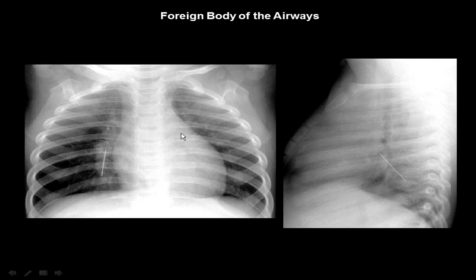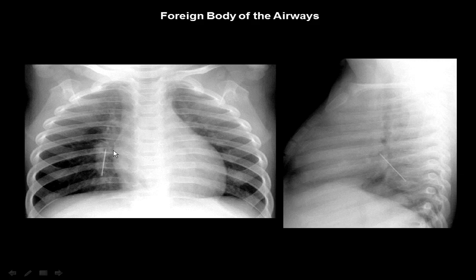This is a plain X-ray film, posterior-anterior and lateral view, showing a metallic shadow in the right lung hilum. In this case, the patient swallowed a needle. This needle can take two pathways — either go to the airway or to the GIT. Here it went to the trachea, then to the airways, and is now inserted at the right hilum. It's a foreign body of the airway.